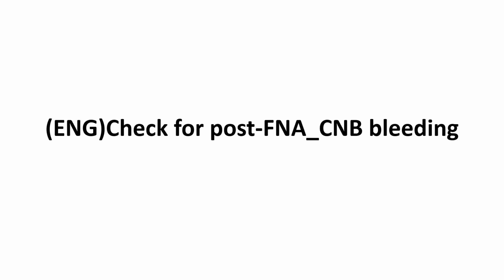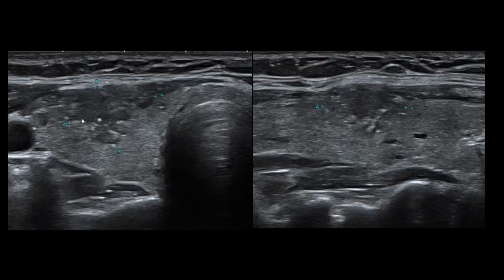Hello. Today I will show you ultrasound findings of post-procedural bleeding after FNA, which is essential for diagnosing thyroid nodules and neck masses, and after CNB, which is occasionally helpful. There is a nodule in the right thyroid lobe that is suspicious for malignancy.